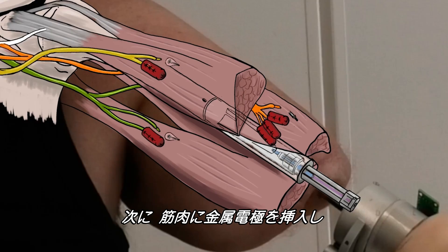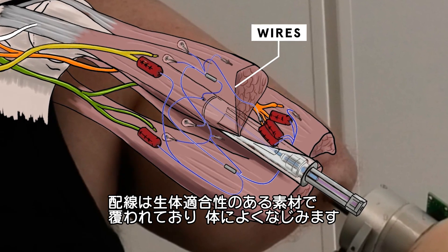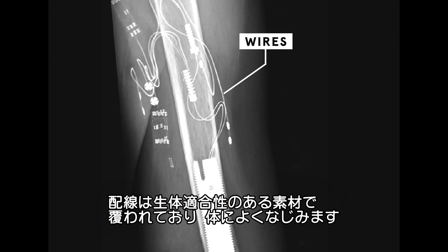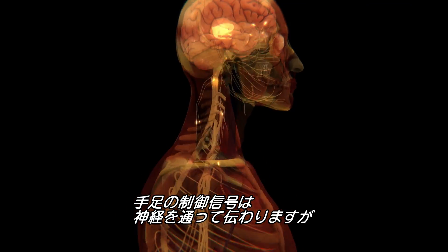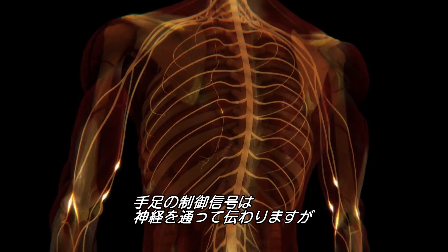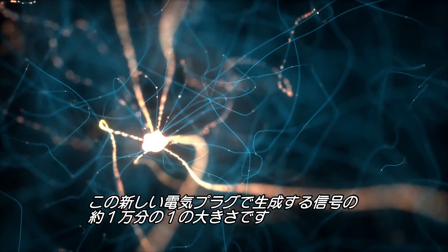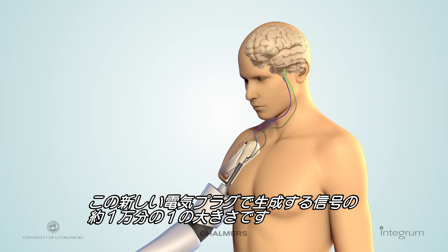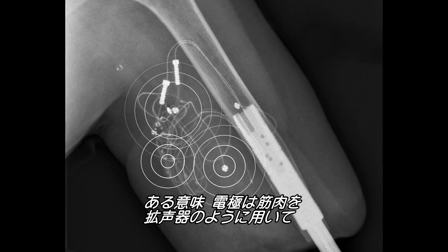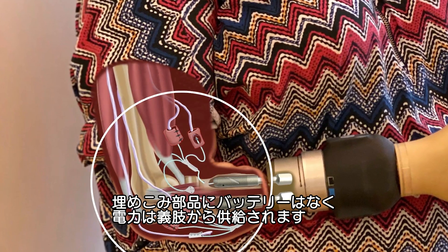Next, a metal electrode is inserted into the muscle and connected to the connector inside the titanium implant. It has a wire covered by biocompatible materials that are well tolerated by the body. The signals from the brain travel through nerves, but these organic signals are about 10,000 times smaller than signals generated by the new electric plugs. So the implanted electrodes use the muscle like a loudspeaker, amplifying signals from the brain to the muscles and to the prosthesis. The implantable part has no batteries — all the power is in the prosthesis.